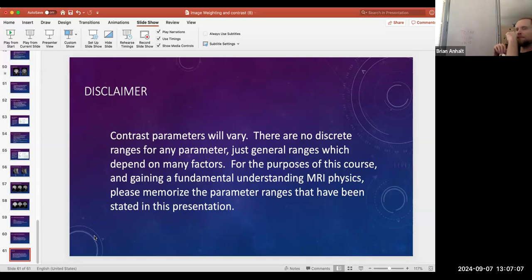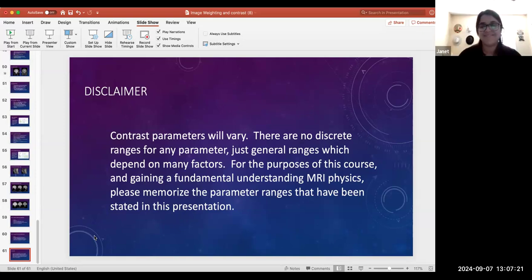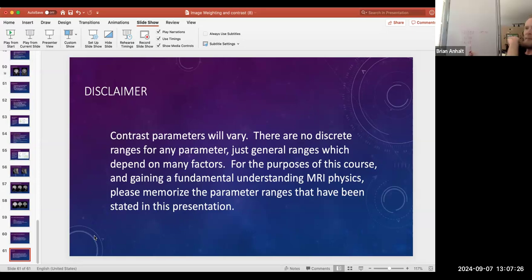What do I got there? Gradient echo. What's the echo weighting? T2 star. You're doing it! Right? Flip angle, small, minimizing T1 information and allowing for full longitudinal recovery in that short TR period. Relatively long TE, allowing for some dephasing to happen to generate contrast between the differences in T2 star decay between different tissues.